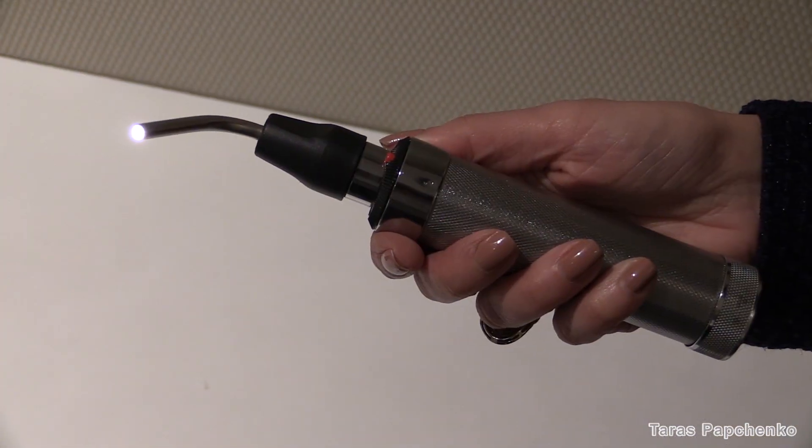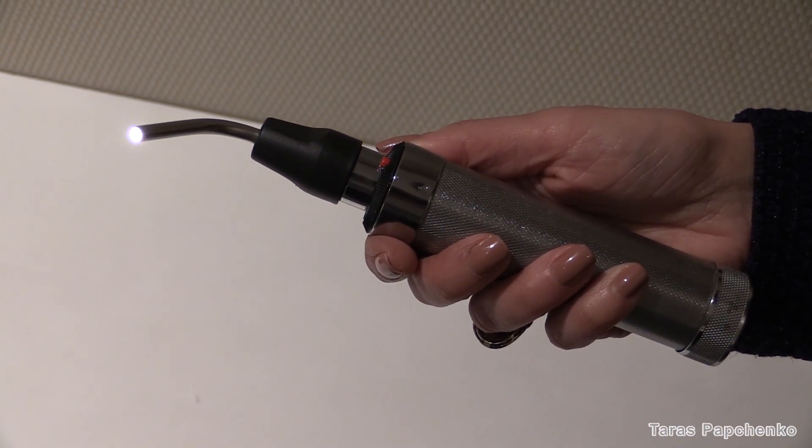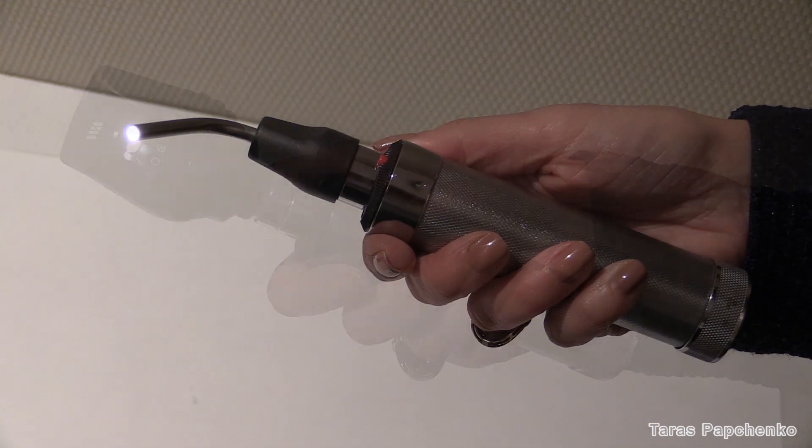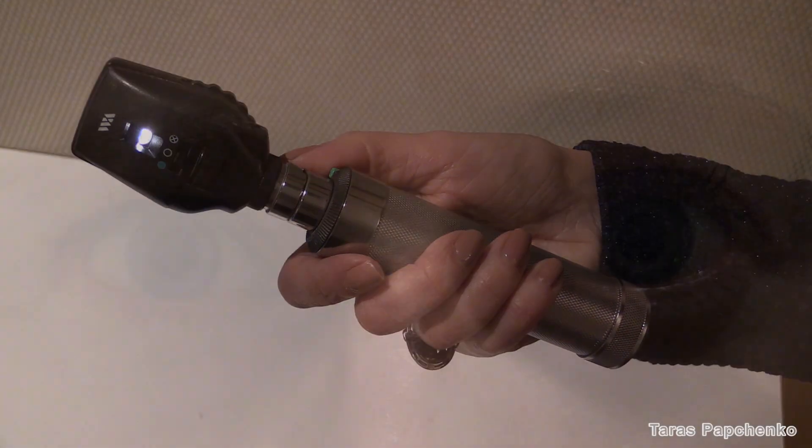First, dim the lights in the room and ask the patient to look into the distance. Use a bright source of light — I prefer a muscle torch, but a direct ophthalmoscope is just as good.